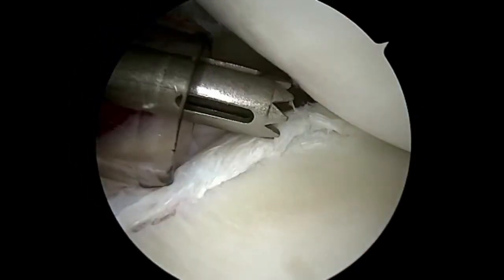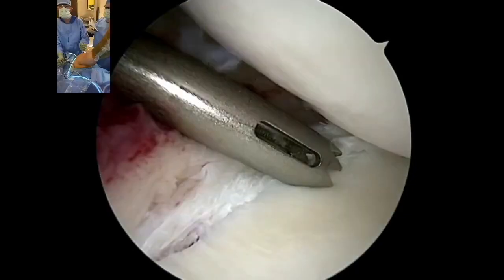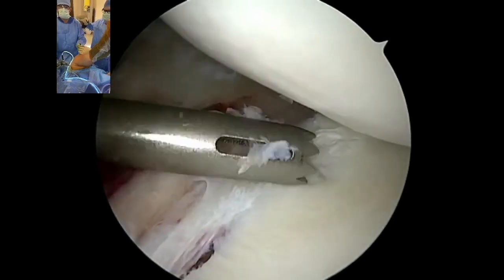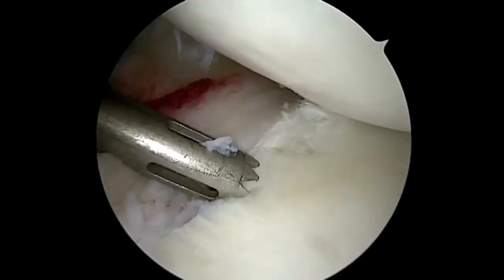We're going to bring a drill guide down to the 5:30 position. It's important that this is on the face of the glenoid and not medial on the glenoid. We're going to drill all of our holes first. We find this to be most efficient and minimizes the need for multiple instrument passes.